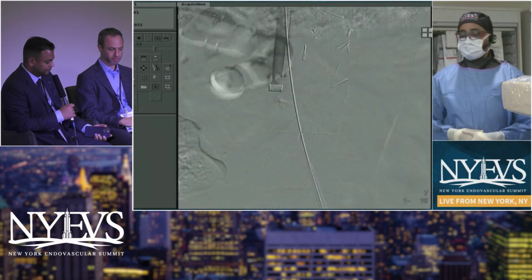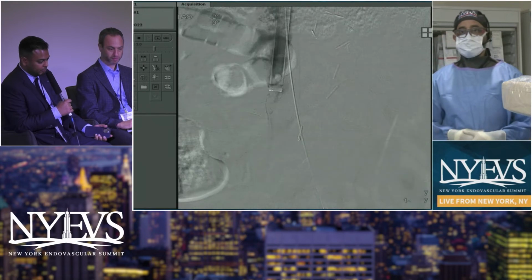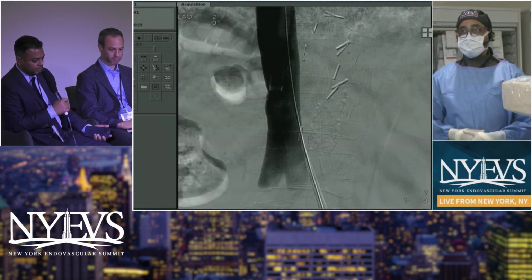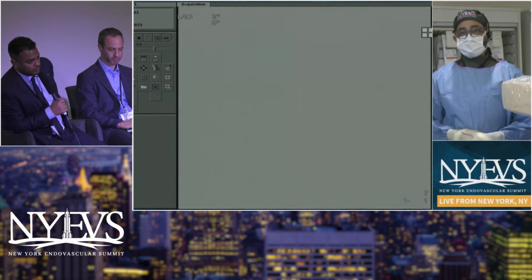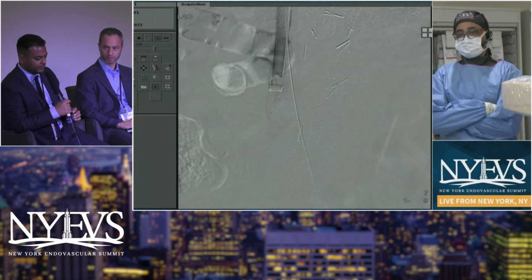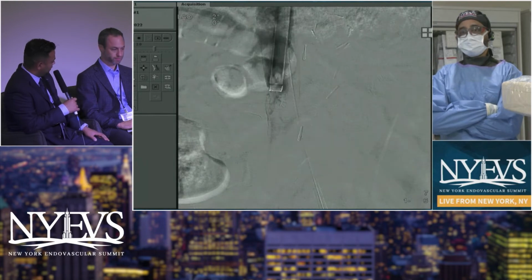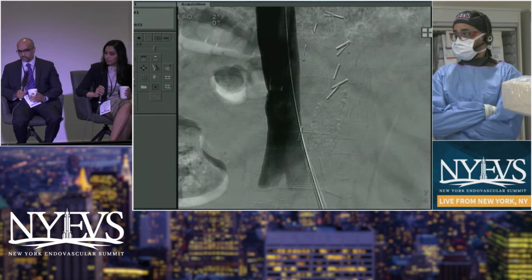Maybe wait like 5 minutes, leave the balloon up, and usually it seals off. What size balloon would you use for a cava this size, Rahul? So we're using the Reliant balloon, which is the aortic occlusion balloon. Some of them, I think, come in 27, 29, 33 sizes. I just pick one. I usually do like a 29. The smaller coda is what I use.